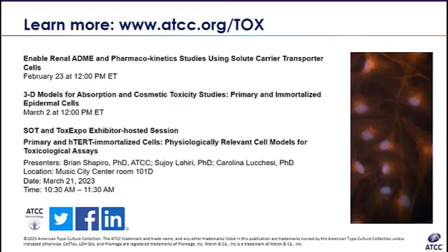But I don't believe any of them specifically need a lysine coating just to propagate them. Typically, the thing about hTERT cells is that they're very similar to primary cells, except they are immortalized. So the media itself is typically going to be the same as your unmodified cells. Right. And so basically you would use mostly the same conditions to get them to attach to the plate, right? Correct.